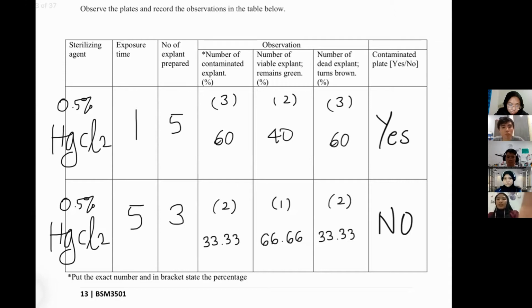The way I got the percentage is 3 over 5 times 100%. And the number of the explant is the same as the number of contaminated. So it's 60%, and the number of contaminated is higher than the number of viable explant. So it's a contaminated plate.